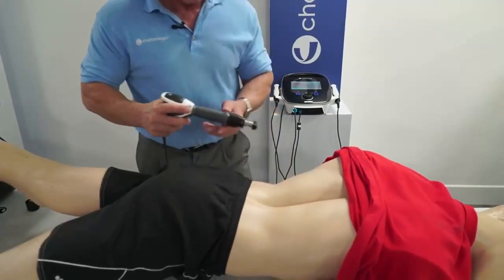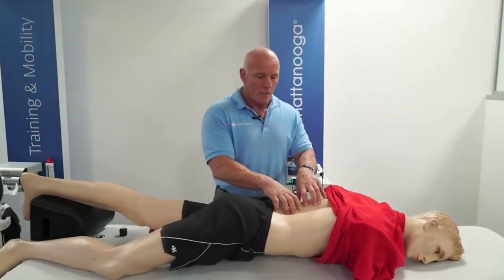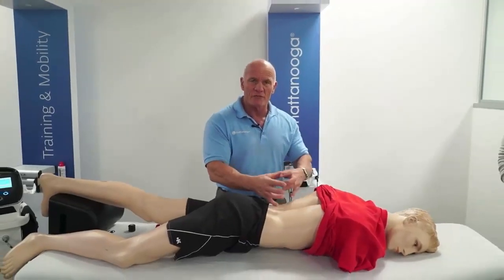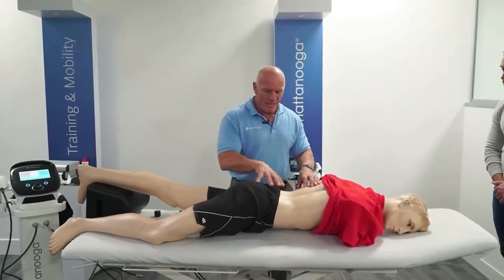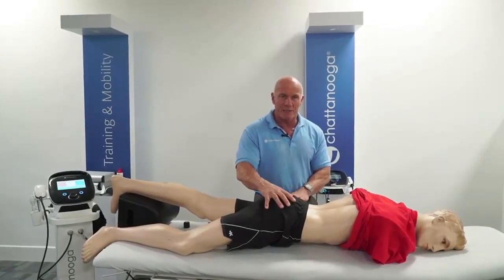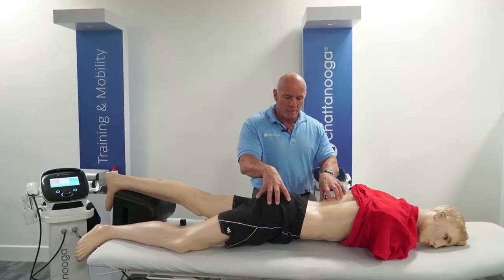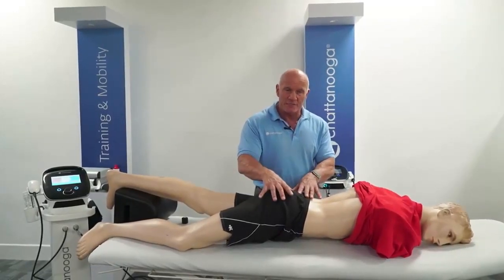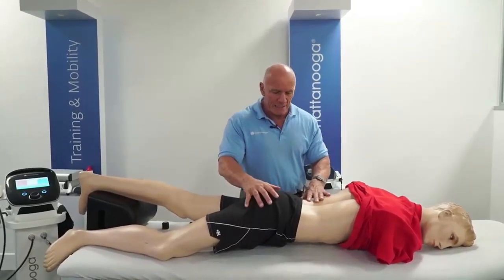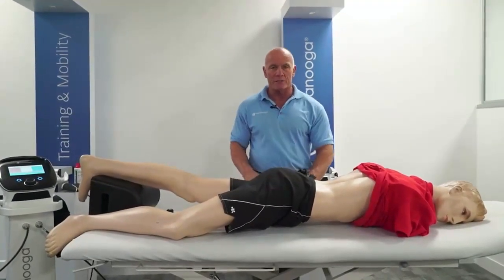Now, what I found is that you can actually get cavitation, i.e. that popping sound where bones are sort of realigning. Okay, so I've actually gone back to this situation here and found that the sacrum's actually back in alignment just by addressing the soft tissue. Okay, but if it still needs further intervention by your manipulation or adjustment, you can use whatever technique you like. It'd be far easier to get back into place having prepared the patient with your radial pressure wave.